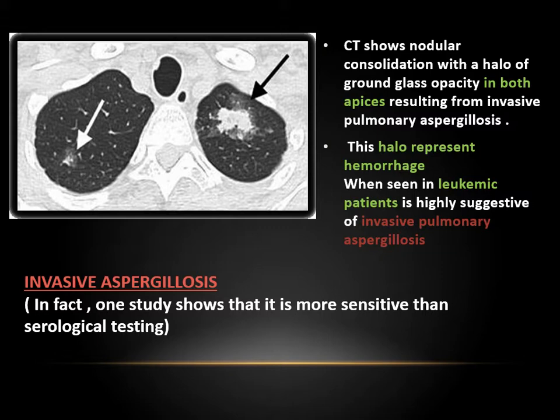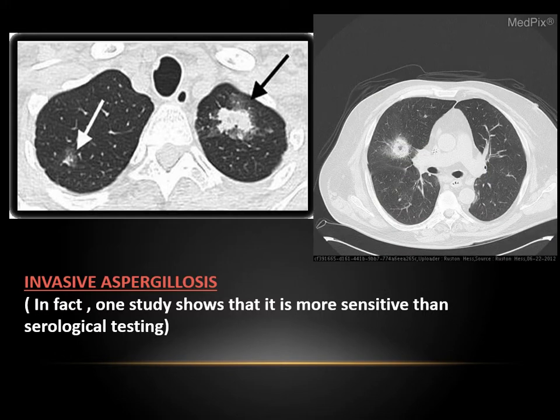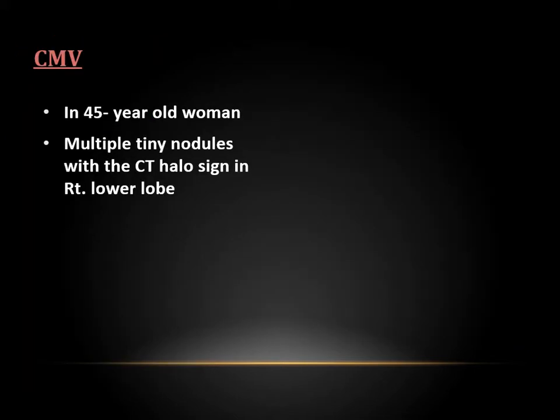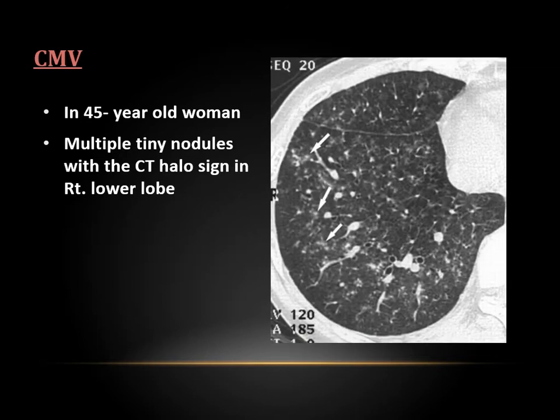This patient shows nodules in the apices of both lung fields, both showing a CT halo sign — this is a leukemic patient. Another CT scan also demonstrates this halo sign. In the literature, finding this sign is noted to be more sensitive than serological testing itself. This is a large case of septic emboli with multiple nodules of different shapes, and as you can see, this pleural-based nodule is also surrounded by ground glass attenuation. This case of cytomegalovirus shows small tiny nodules also surrounded by the CT halo sign, mainly in the right lobe.